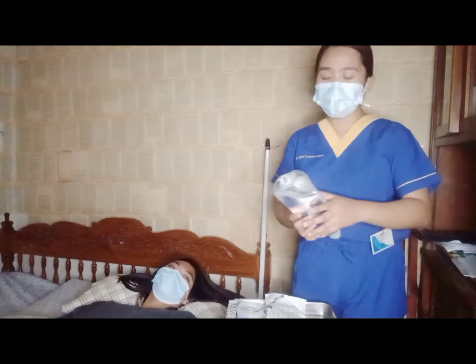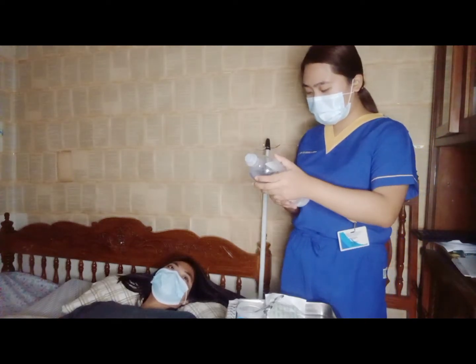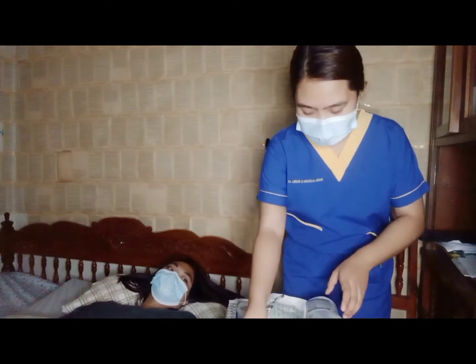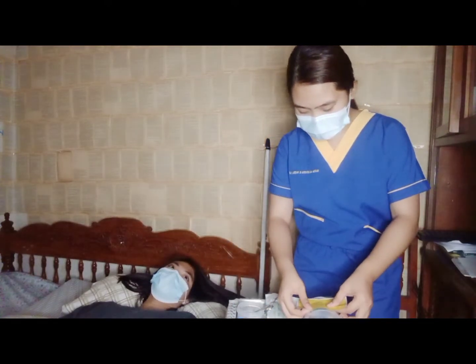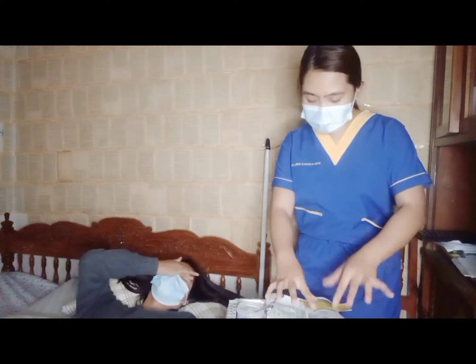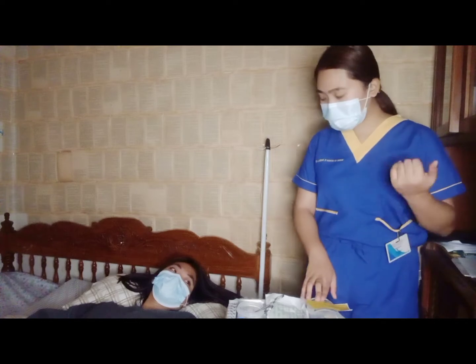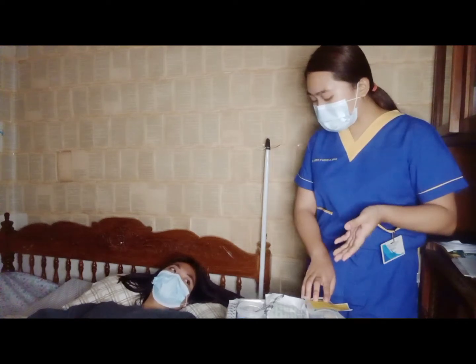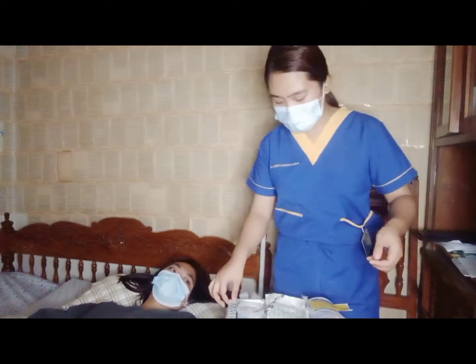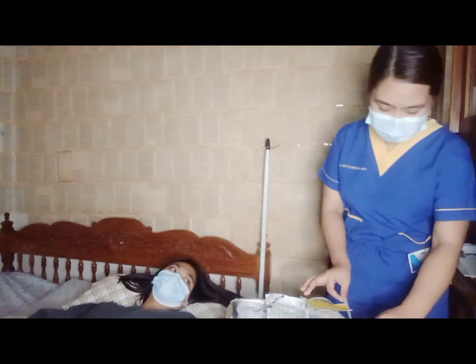So, remove the outer wrapper of the IV solution. And then, let's check the expiration date. Then, we will put on a label. Para saan po yung label, ma'am? Ito pong label, ma'am, nilalagay po natin ito sa may solution container natin para makita ng ibang nurses kung ano po yung drugs added or yung mga medicine na naidagdag dito sa ating solution. Then, you will put on a time strip.